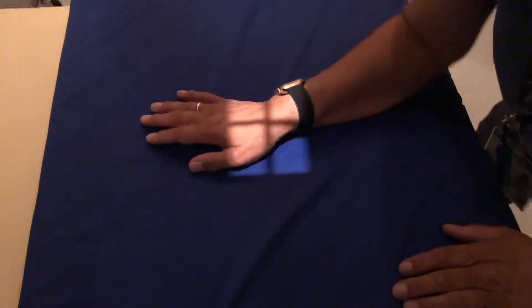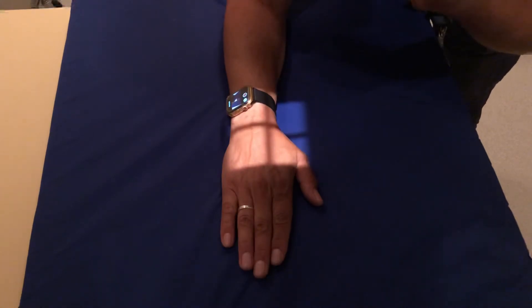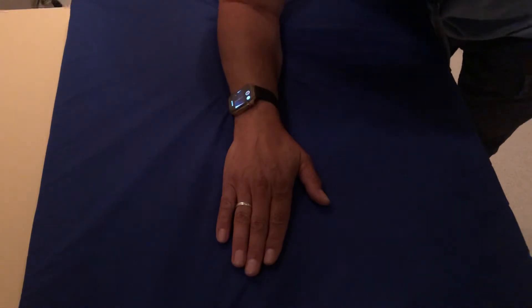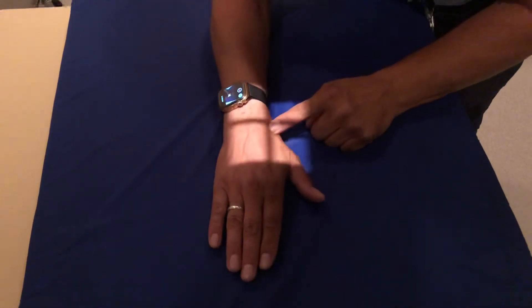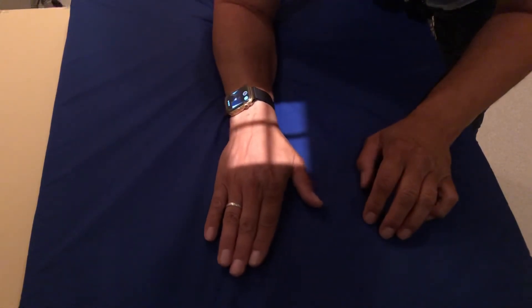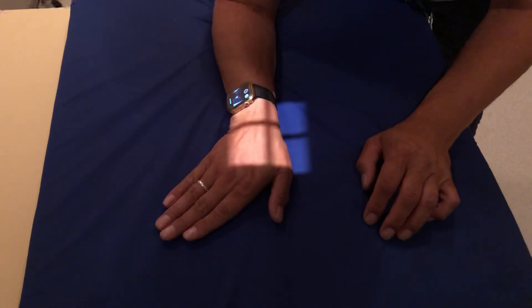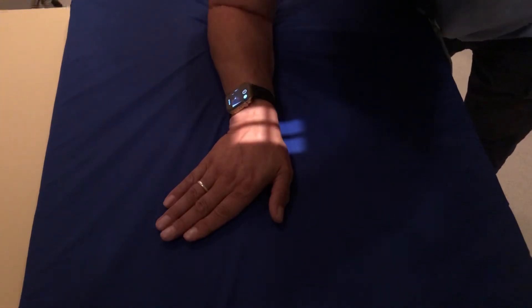Remember, you've got the 15-degree angle on the tube. You want the x-ray tube to be angled so it goes up the forearm, and you're going to center right here. Have the patient do some ulnar deviation — bring it out to the side. Cone down pretty close here because it's a very small bone that you're going after.